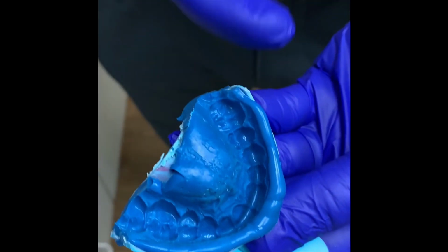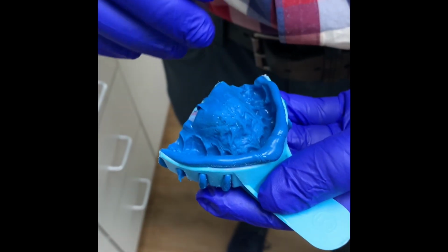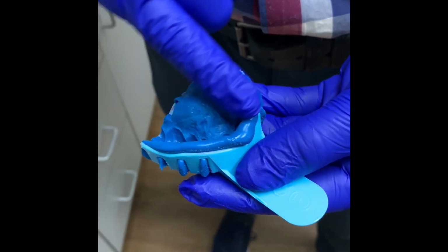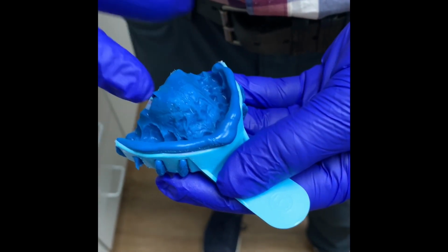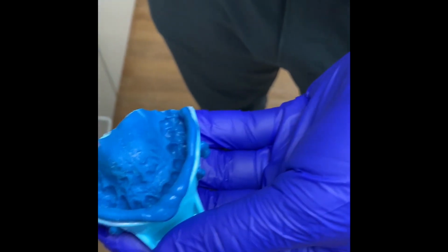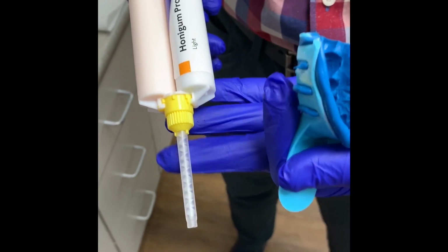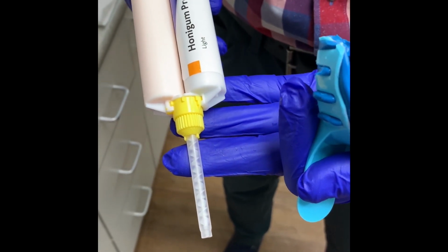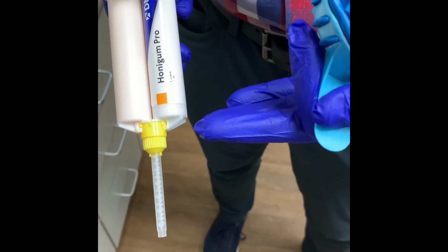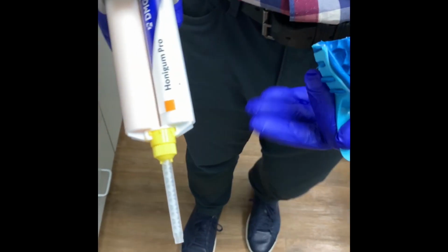Now what we're going to do next is make sure that it's completely dry, and we're going to reline it with light body impression material. One thing to consider is that this is a PVS material, and latex and powdered gloves can affect the set of PVS, so make sure you're wearing latex-free gloves. Also, don't worry about placing the pointed tip on the end of the light body impression material, and you want to use a material compatible with the putty that you used. In other words, a DMG product for the putty, a DMG product for the light.